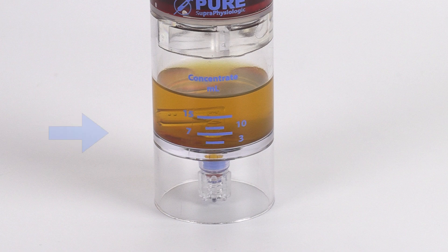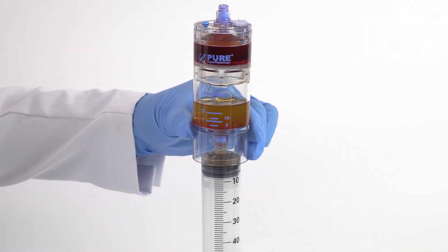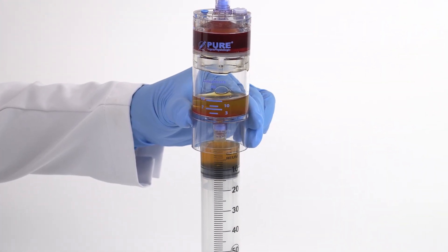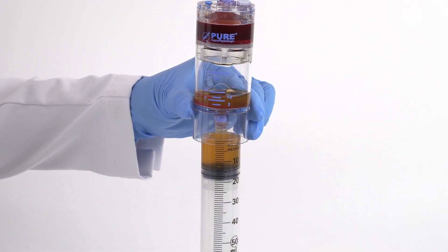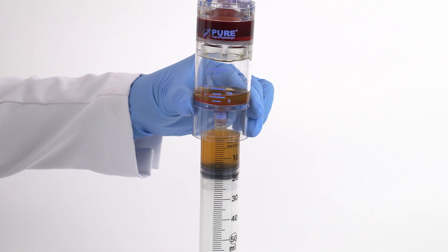After centrifugation, the bone marrow buffy coat layer will be clearly visible at the bottom of the device. Remove the clear non-vented cap from the bottom port and attach a sterile syringe. Aspirate plasma, leaving seven milliliters of solution in the device.